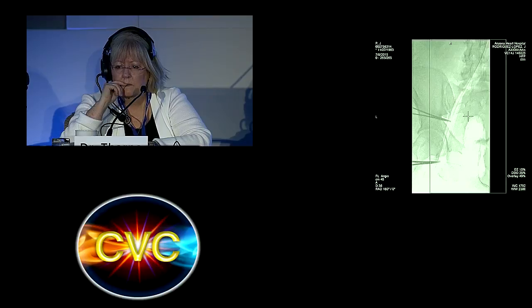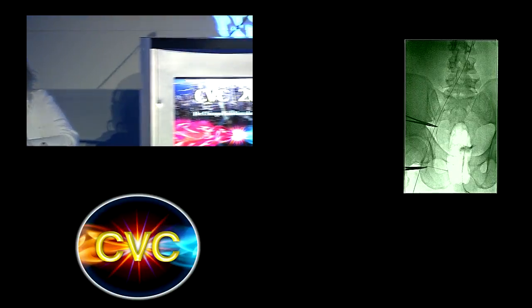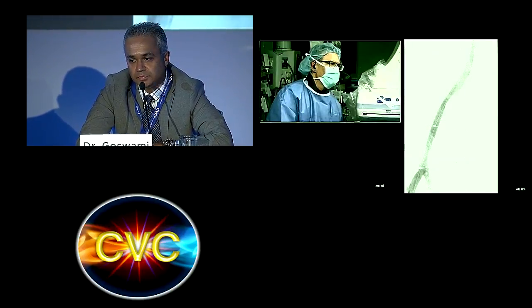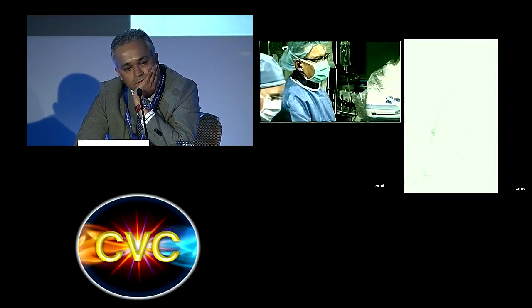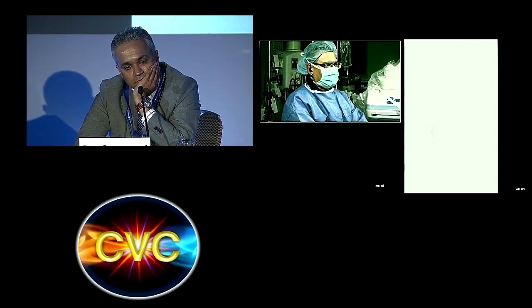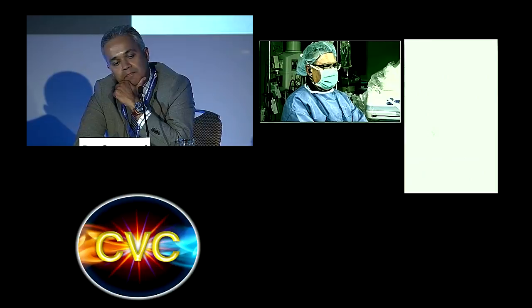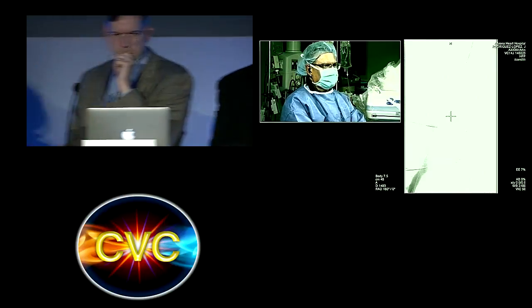At least by the IVUS imaging, it looks like you got a highly fibrotic lesion with a lot of negative remodeling, and just the balloon appearance on the post-dilatation makes me feel a little bit better. You went with a wall stent. A little more radial force there. Yeah, definitely there's some fibrosis and scar tissue in that area. If it were me, I would stent the whole thing. I don't know. We could take a vote.